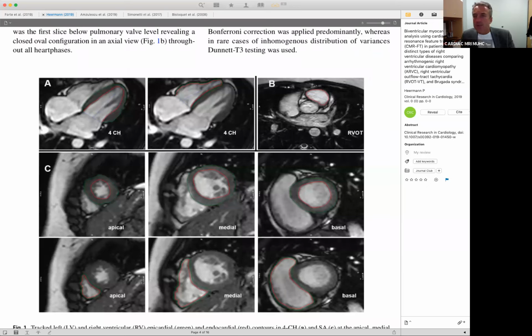So there is another comment. As shown, there are relatively large differences between the techniques. If we would start a new study on the effects of, for instance, PCI on tissue tracking or echo speckle tracking, what would you recommend? My recommendation, first of all: if it's a PCI, that's clearly addressing an ischemic problem, so that should be the circumferential strain more than anything else.